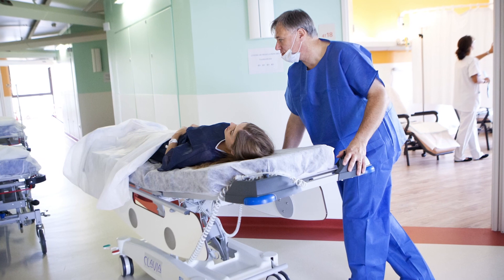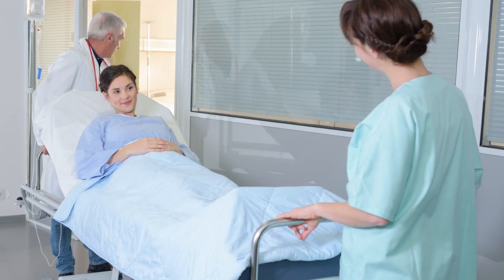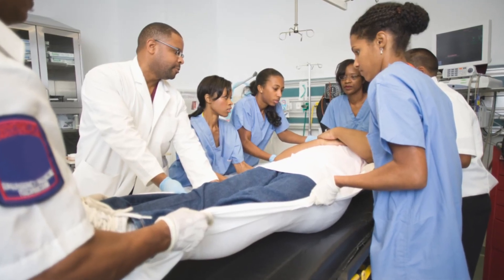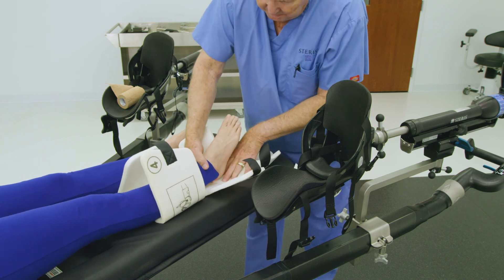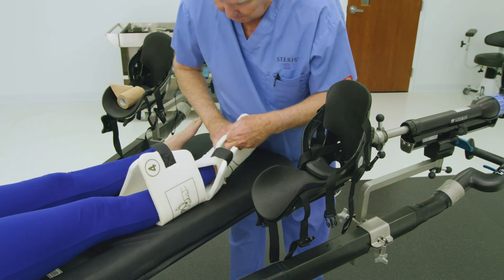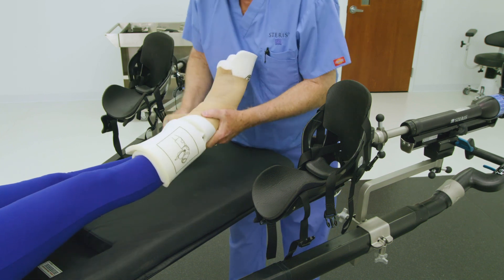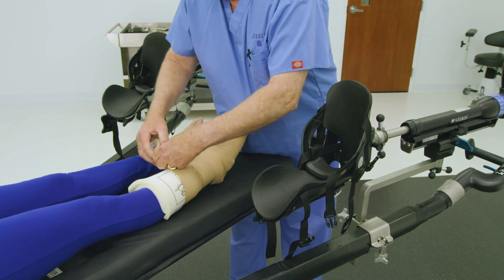The table is now ready for patient transfer. Execute patient transfer using facility protocols for safe patient handling and ensure even patient weight distribution. While the patient is still in a supine position, prep the patient's feet for the traction boot with the Steris traction boot disposable pad or by using local OR materials such as gauze wrap and coban. If using the Steris disposable pad, instructions for placement are located on the disposable pad itself.